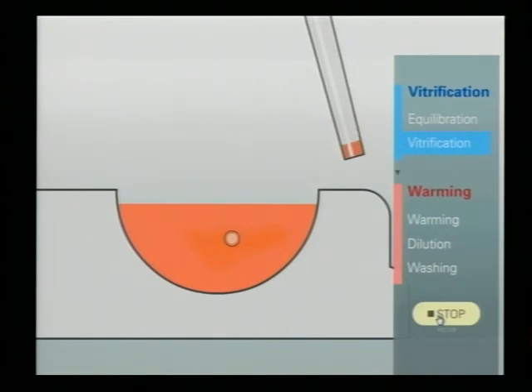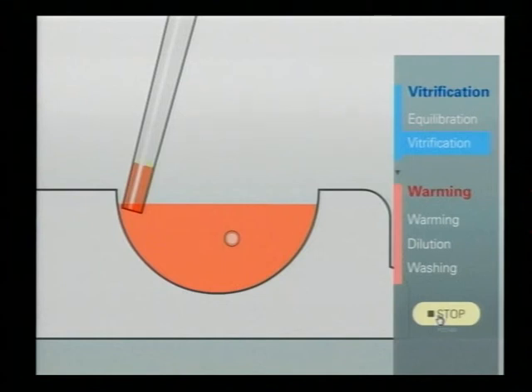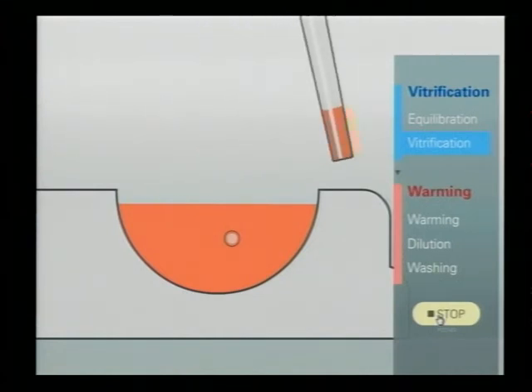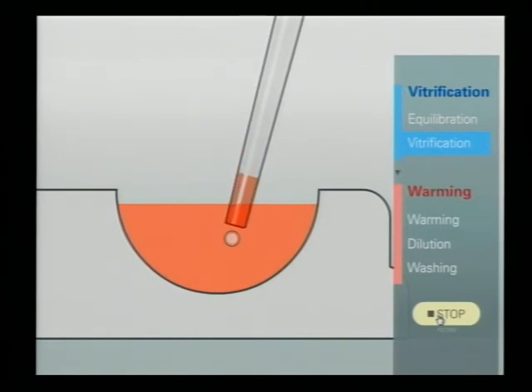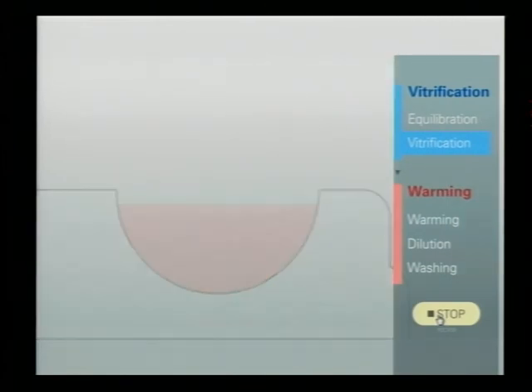And again wash inside of the pipette. Wash, wash, then aspirate fresh VS and take oocyte as top as possible and place it on the surface of a cryotech sheet.